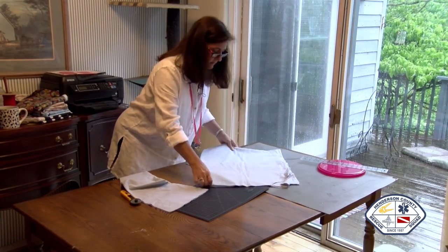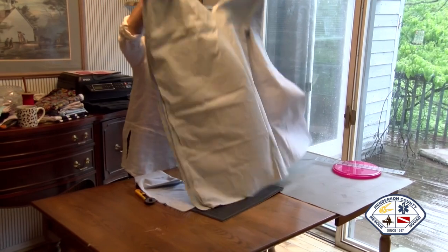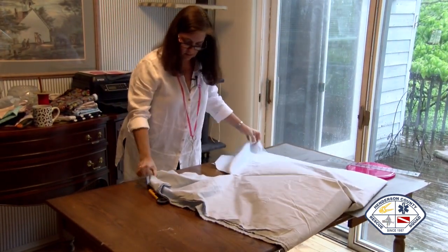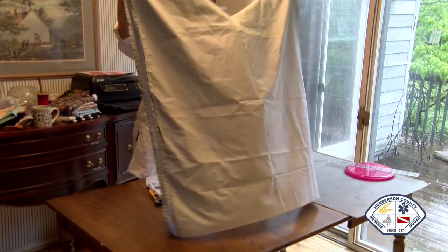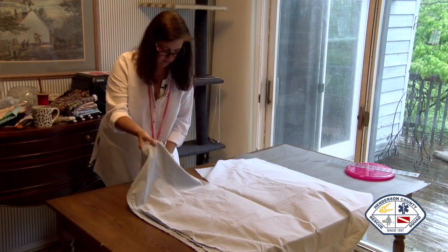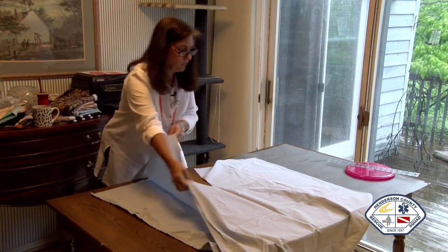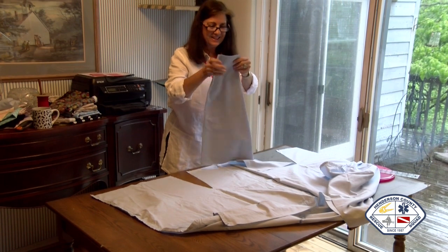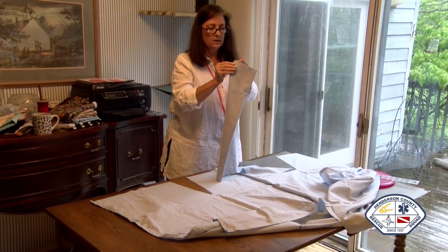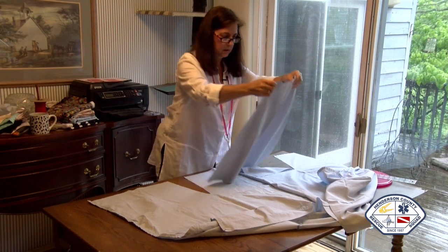So now let's get our sleeve in. This is what it's going to look like when you've got your sleeve cut out. Let's do just one layer. Isn't this fun?